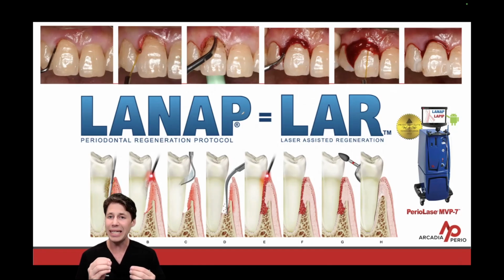So in figure E, we're going to do hemostasis, not coagulation. Coagulation kills cells. Hemostasis, live viable stem cells in a gelatinous clot. This is going to be a longer pulse duration, 550 microseconds to 650 microseconds to get that gelatinous clot to form. Once the clot is formed, what we do is we do our occlusal adjustment, right?